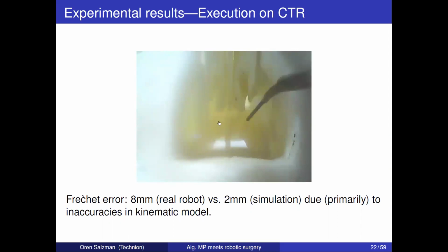And we need to look at the specific error for the specific system. Right now, Ron Alterovitz with his group and with collaborators at Vanderbilt are looking at experiments in pig lungs. And I think they're going to have a paper out pretty soon talking about errors for these. What are these systems even capable of doing?